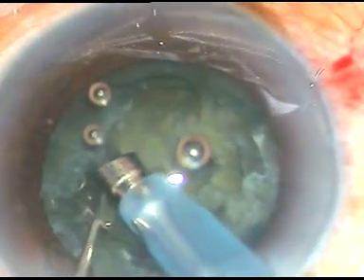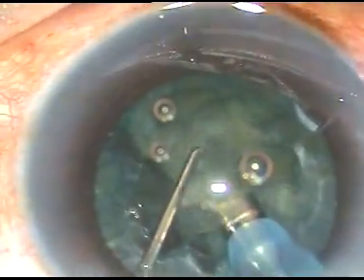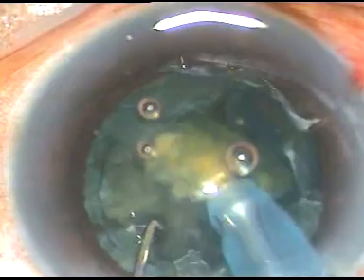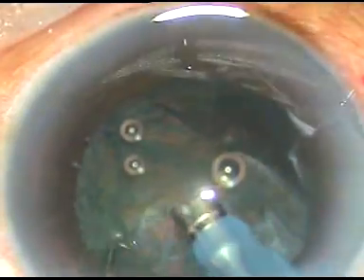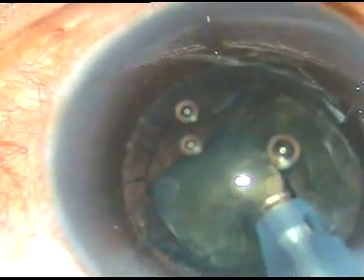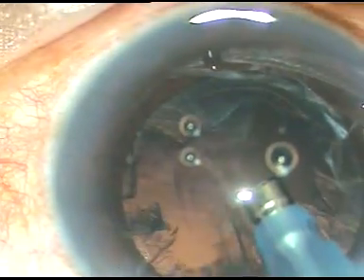This grade 3 nuclear sclerosis usually cuts very easily — the nucleus is usually brittle and you can very easily chop it. When you get accustomed to chopping this kind of cataract, you can go to a little harder grade, like grade 3 plus or grade 4. So for beginners, this is the ideal case to start direct chop.